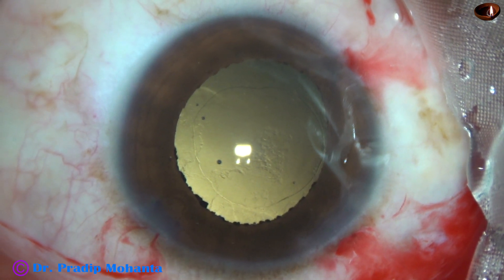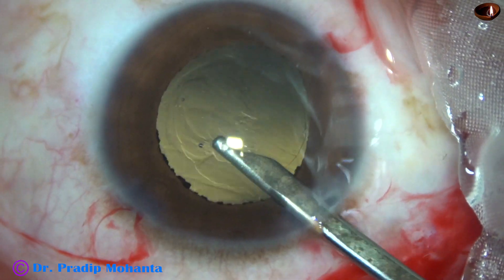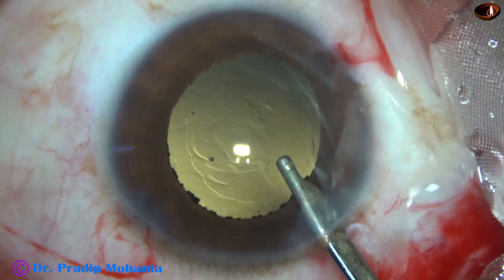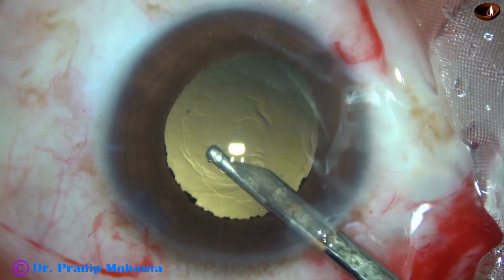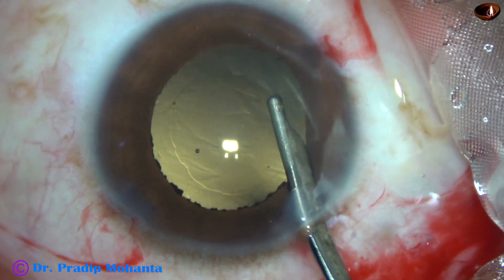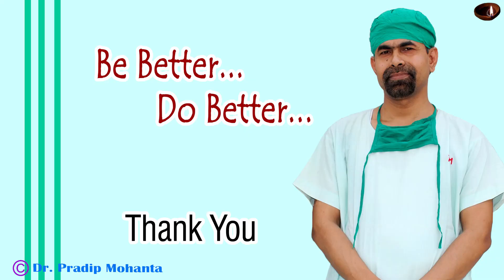Now I'm going to refer this patient to a vitreoretinal surgeon. The surgeon will take up this case after three days, once the wounds get nicely closed. I'm not going to put any suture to the wound — if necessary the retinal detachment surgeon will put one. I hope it will not be necessary because the RD surgery is going to be done after three days. Thank you very much for your attention — hope this video will help you in managing such cases.